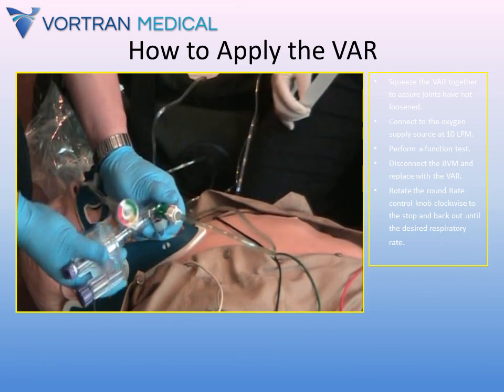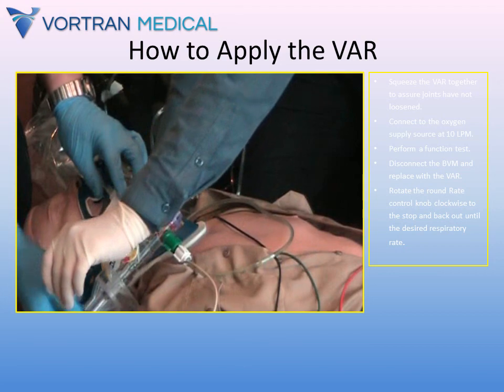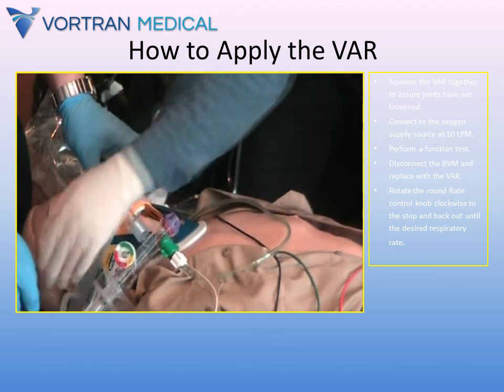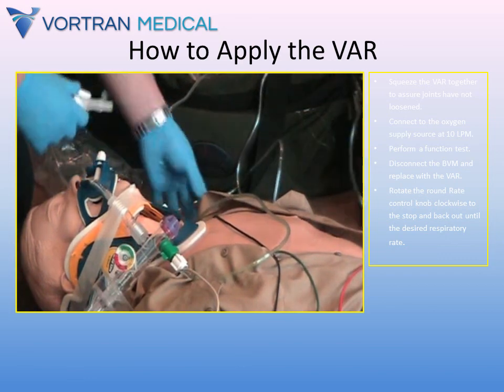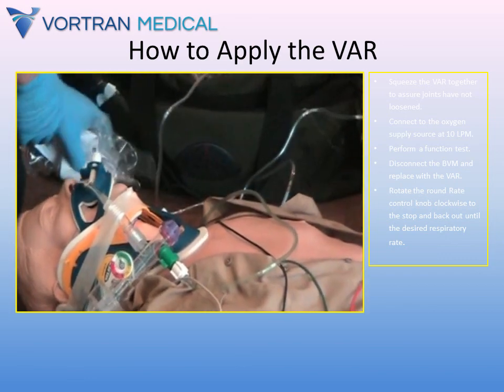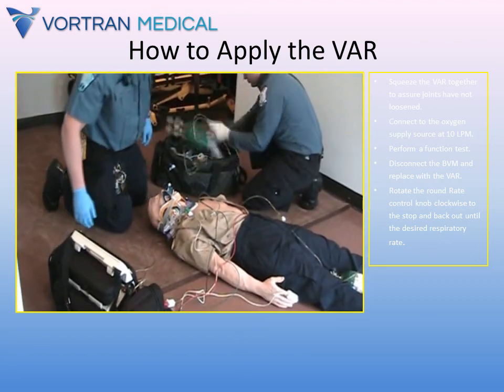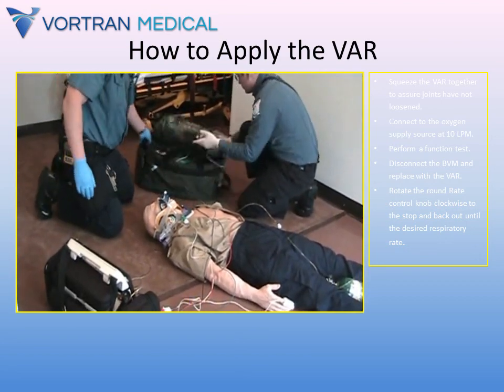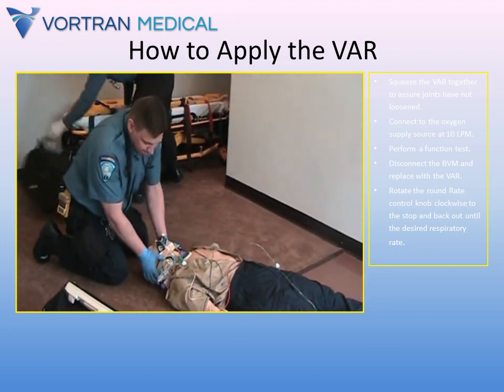Cycling, we have good chest rise. Secure the VAR to the collar. Secure. And let's get the scoop stretcher and we'll go back.